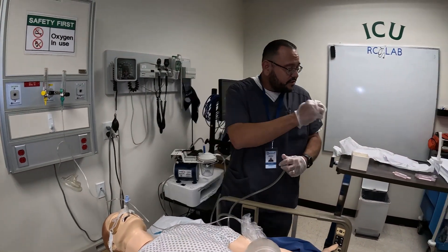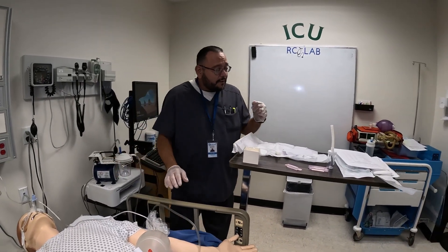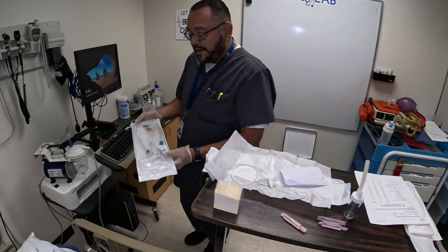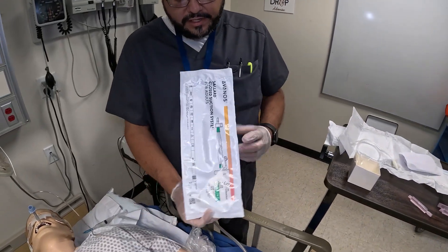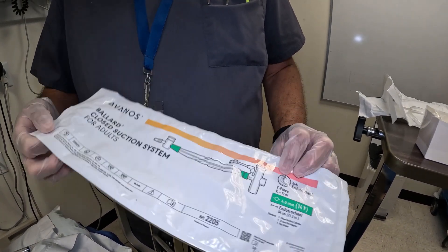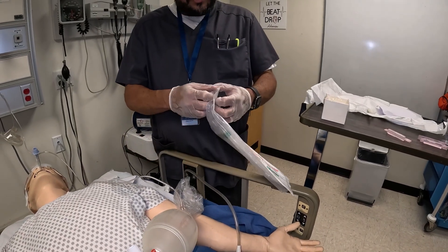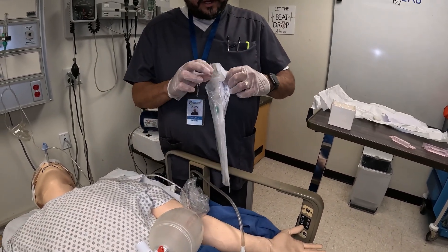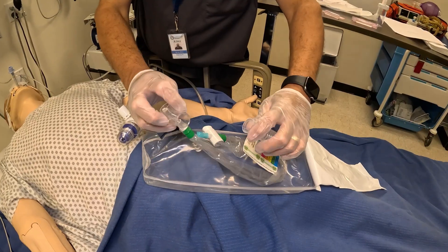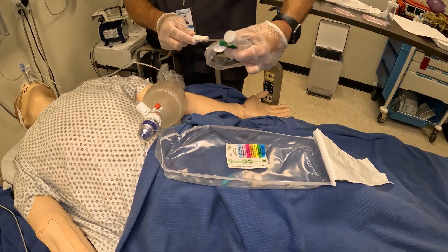When finished, discard your Ballard or suction catheter and clean up your area. Now for demonstration I'm going to demonstrate with a suction Ballard. This is an ET tube suction Ballard — it will say ET tube on it. If you get a tracheostomy one it will say tracheostomy and it will also be shorter in length. This one is 54 centimeters; the one for a trache is going to be shorter. So we're going to open this up and assemble it.